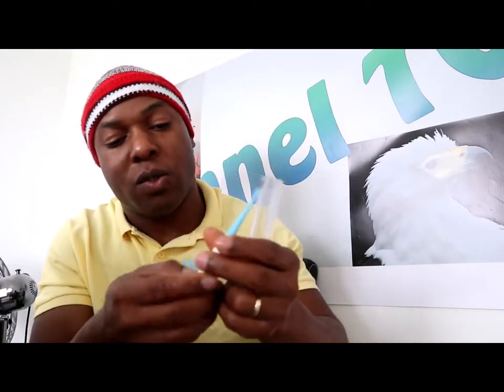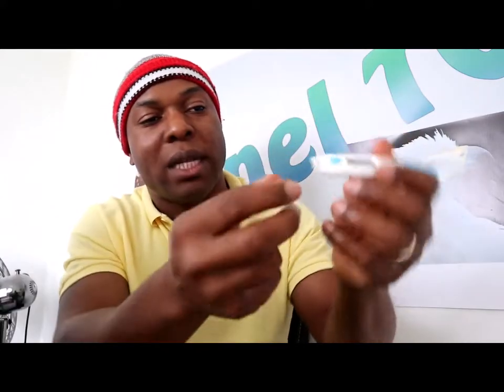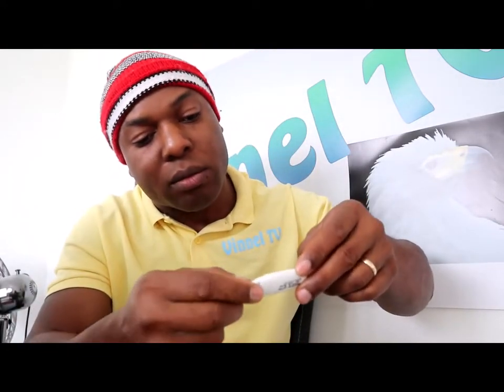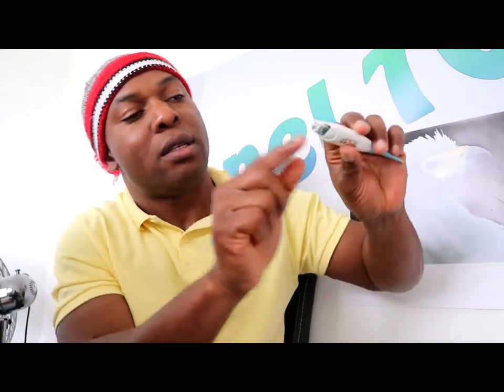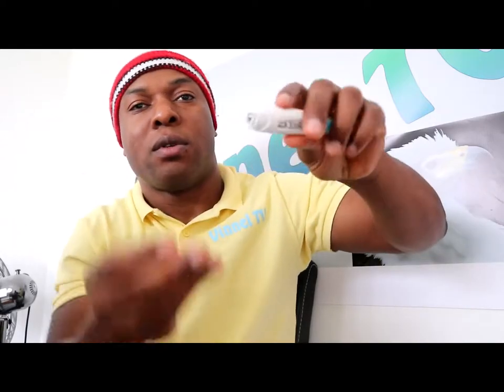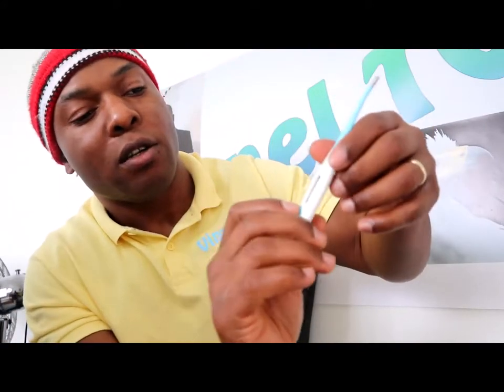Okay, now to change the battery, because it contains a battery, you need to push this out. That's to change the battery. You need to pull it out. The battery is underneath. You can see the battery is inside. So if you take the battery out, then you put the battery back in. This is the battery. So guys, this is how to change the battery. You take this out and the battery will come off, then you put the battery back on. You hear a click sound, and to press it on you need to press it here.